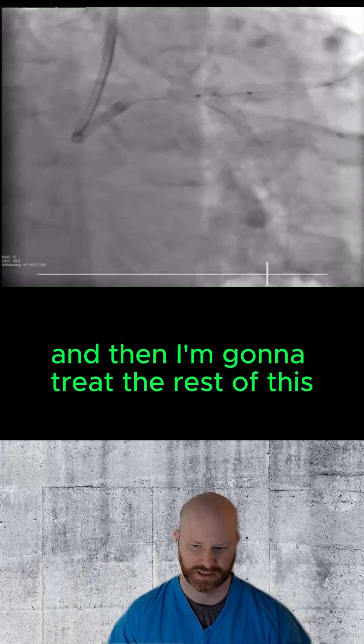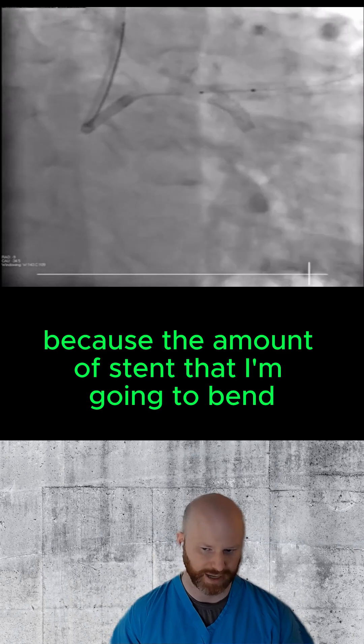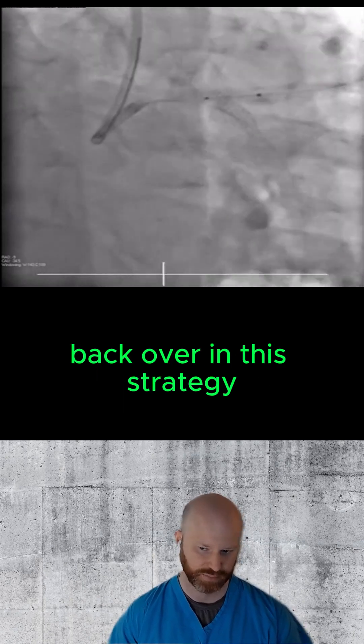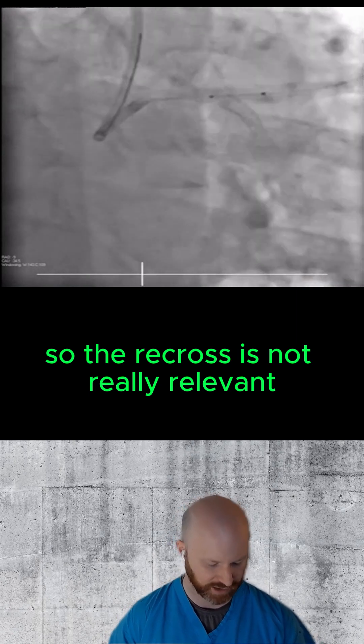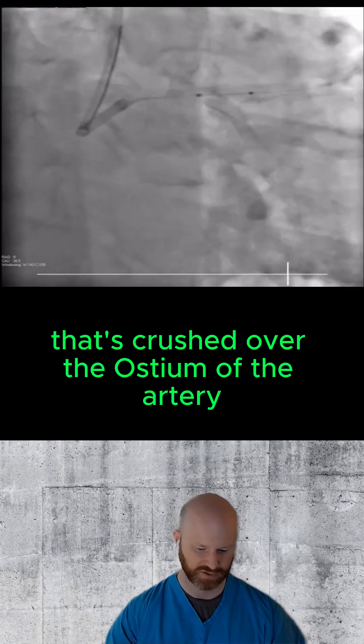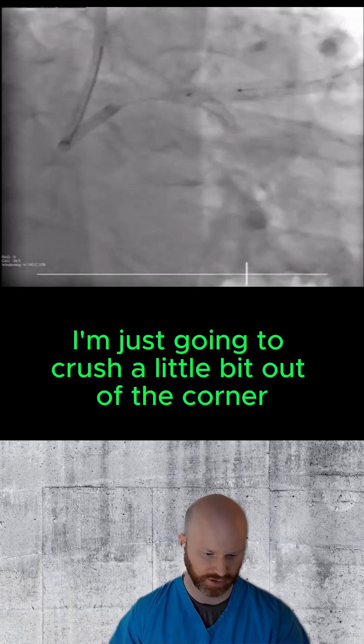I'm going to treat the rest of this a lot like a DK crush without the double kiss being completely necessary. Because the amount of stent I'm going to bend back over, given this angulation, is not a lot. The recross isn't really relevant because I'm not going back through a stent that's crushed over the ostium of the artery — I'm just going to push a little bit out of the corner.